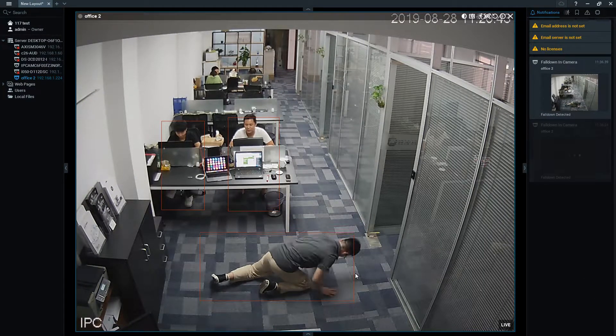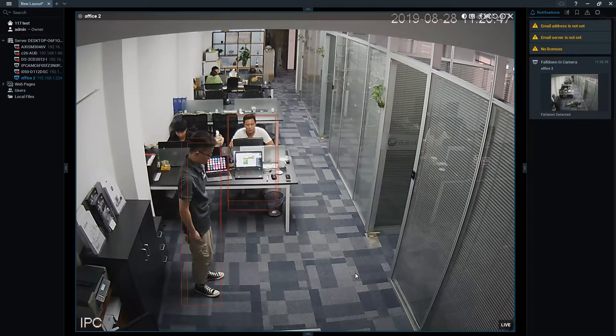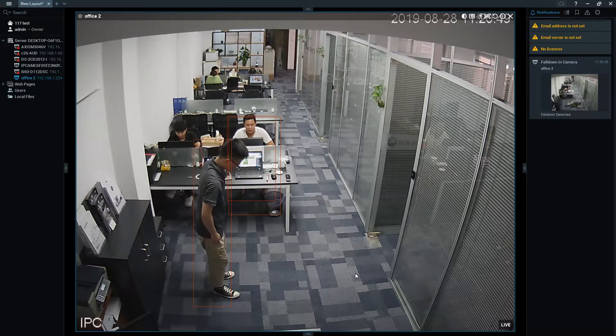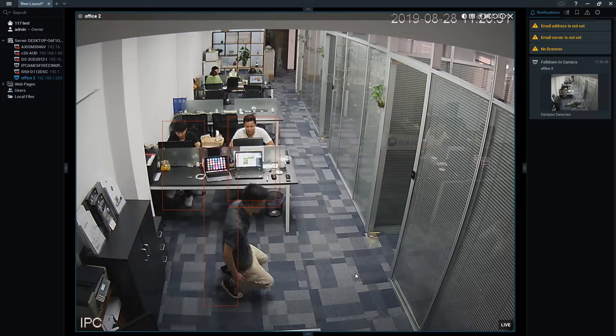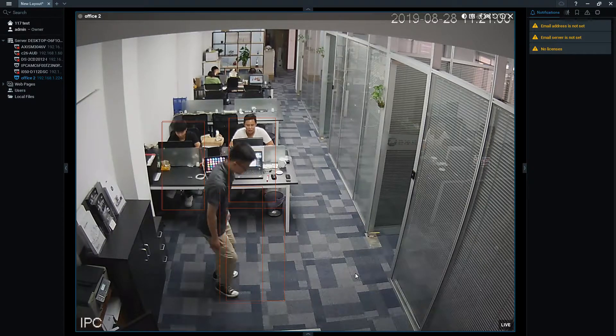Now we are going to try another posture, which is a kneeling down posture. As you can notice, if you kneel down the alarm won't go off because it's not a fall — you are just kneeling down on the floor. So the alarm won't go off; it has to be a fall.